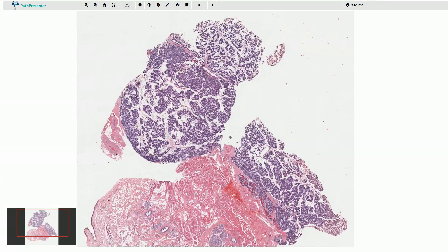Canalicular adenoma is a benign epithelial salivary gland neoplasm which is arranged in interconnecting cords or tubules made out of columnar cells. It is a quite rare salivary gland tumor. It is more common among females and it typically arises in the upper lip.